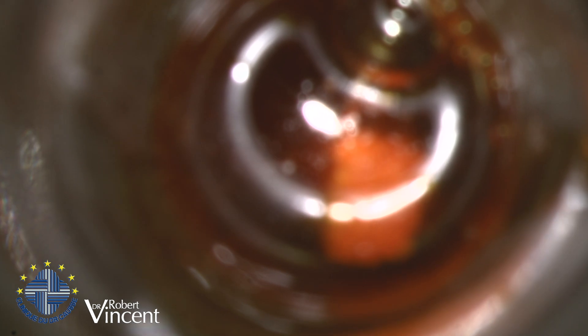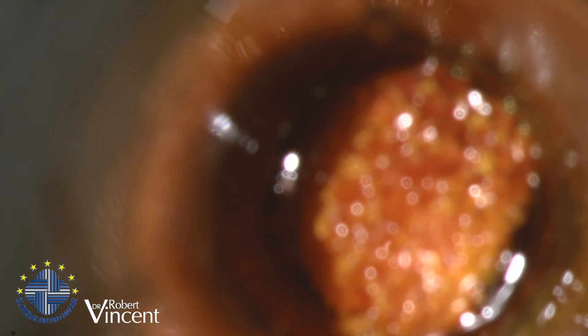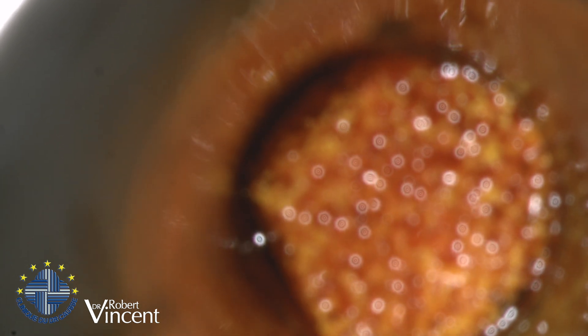I think that went well — an interesting case. Regarding how I do the measurement: I'll show you. I use the mid-surface of the incus — not the upper surface, not the lower surface, but the mid-surface.